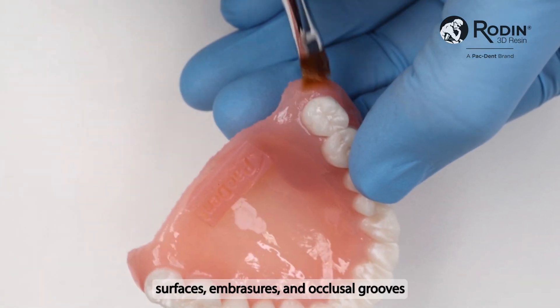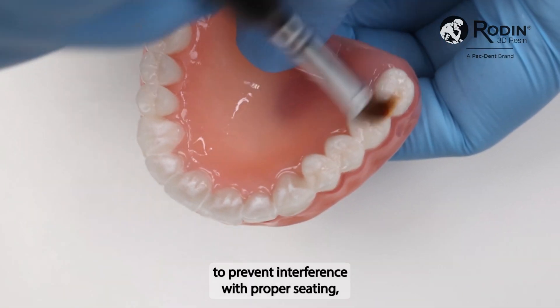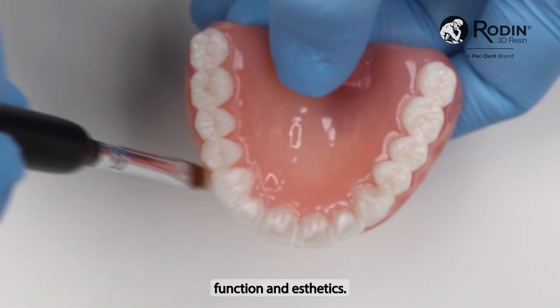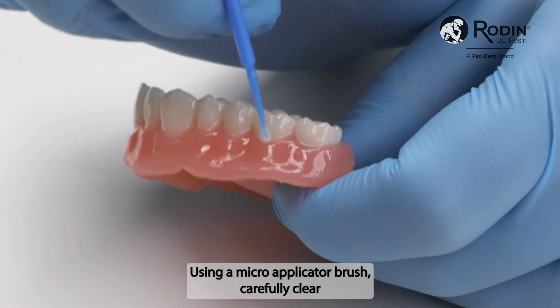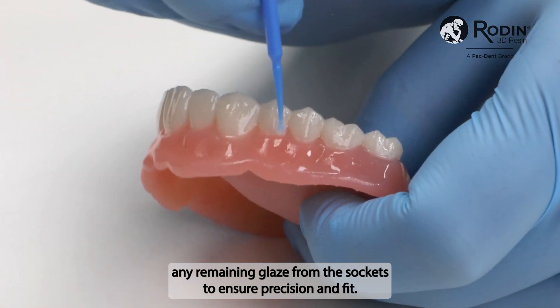Remove any excess glaze from the intaglio surfaces, embrasures, and occlusal grooves to prevent interference with proper seating, function, and aesthetics. Using a micro applicator brush, carefully clear any remaining glaze from the sockets to ensure precision and fit.